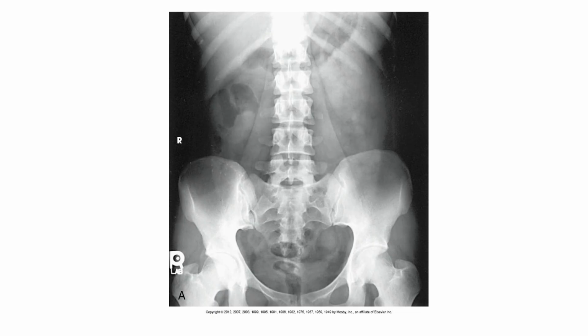If you keep following that line around, you can see a bean shape on that left side. It's actually easier to see the left kidney on this radiograph than the right one. The right one is always crowded by the liver, and it makes it harder to make out. But you can see both of them. That helmet-shaped gas bubble isn't doing us any favors though.